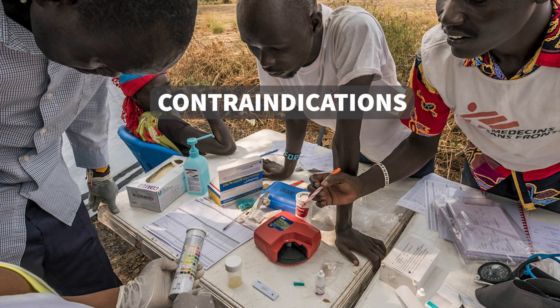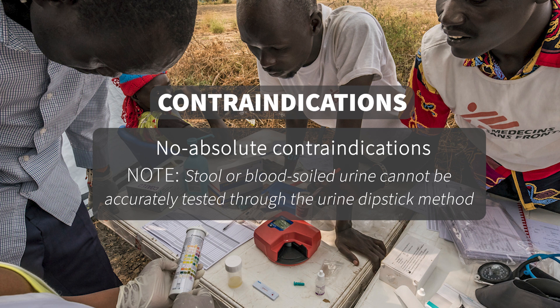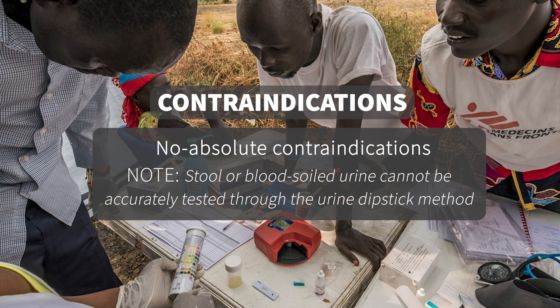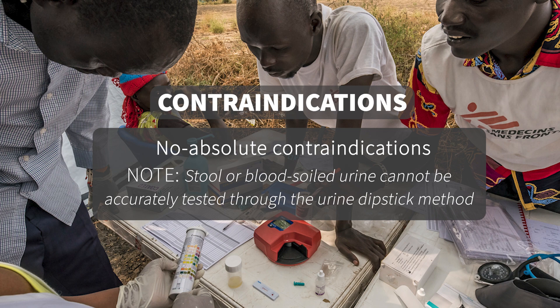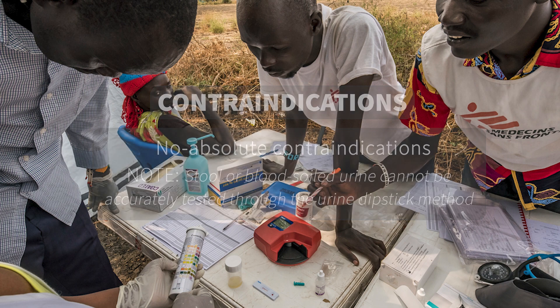Contraindications. There are no absolute contraindications for urinalysis using the dipstick method as it is a non-invasive procedure. However, it should be noted that stool or blood soiled urine cannot be accurately tested through the urine dipstick method.